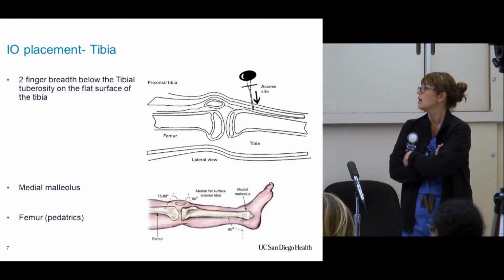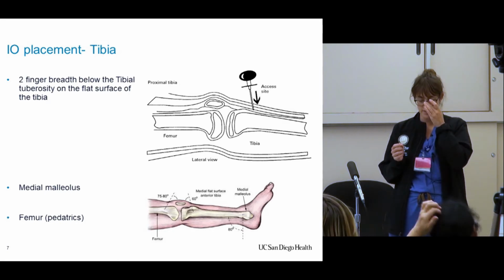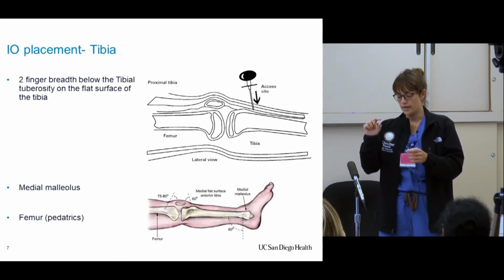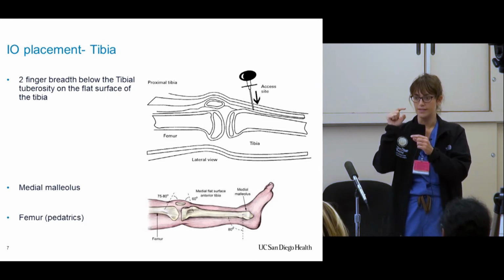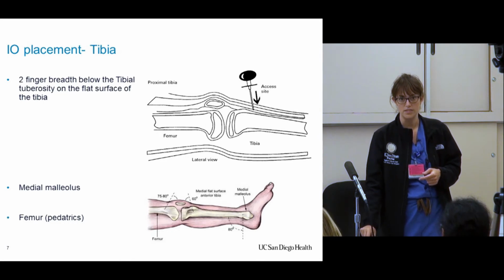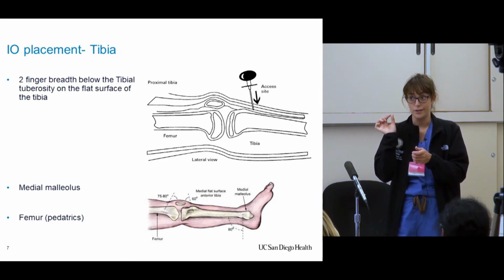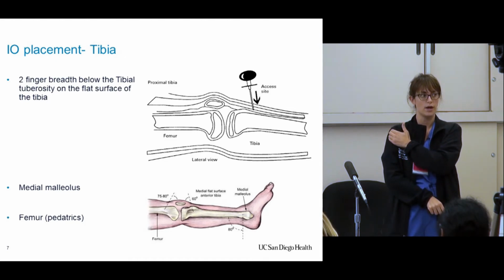Okay. When you do this, sorry, I don't have one with me. So the steps of it are that you pick your needle size, you can push down on the skin where you're going, estimate that the needle is going to be deep enough that you can get into the bone, okay? It's a magnet, it just pops on, and you pick your location, you prep the surface.